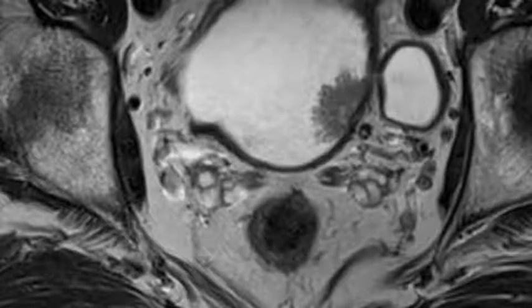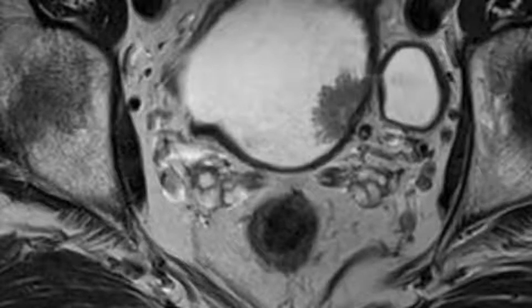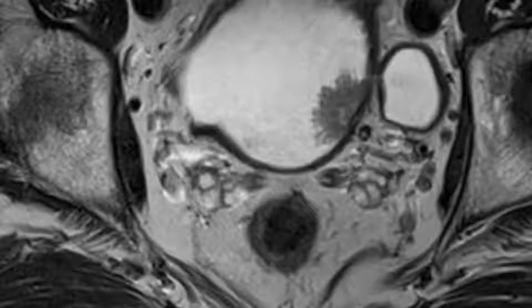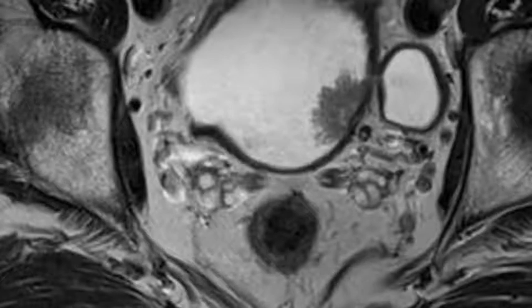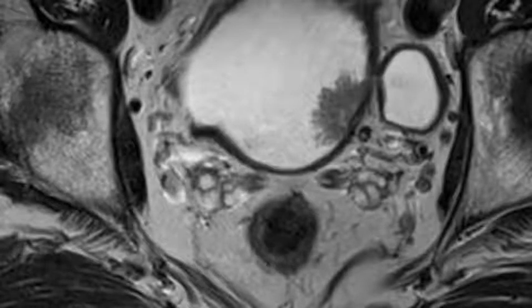Dynamic contrast material enhanced MR imaging. The usefulness of dynamic contrast enhanced T1 weighted MR imaging is debatable, with some studies showing that it is a useful technique and others showing that it is of no additional value. Three-dimensional fat-suppressed fast-spoiled gradient echo T1 weighted images are obtained before and after contrast material enhancement. Three-dimensional acquisition allows multiplanar reformation.